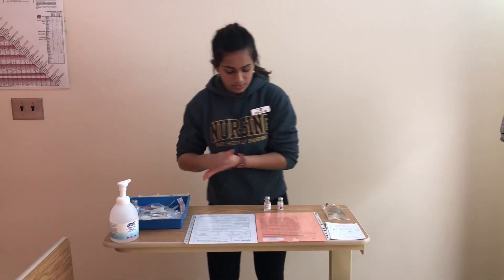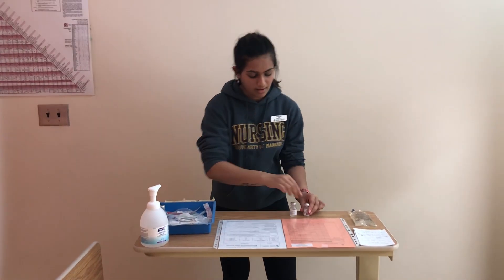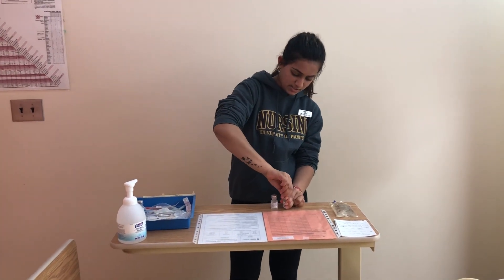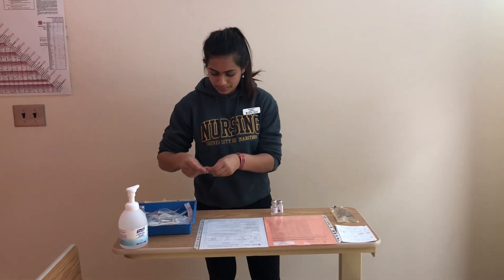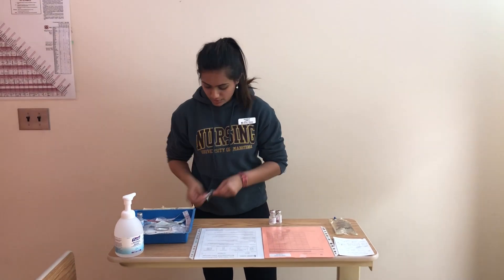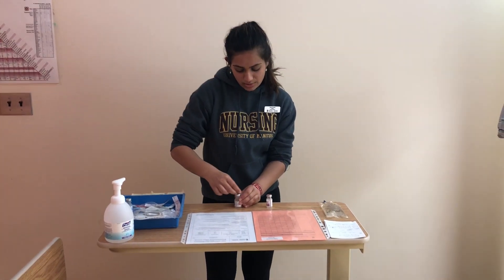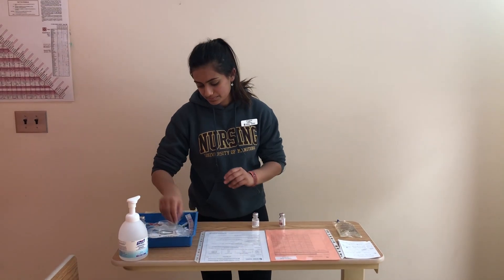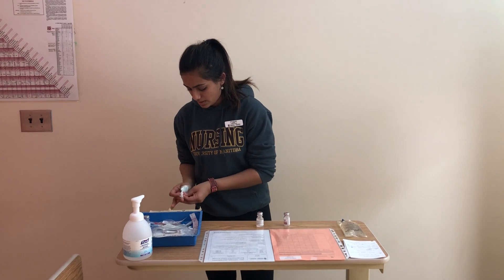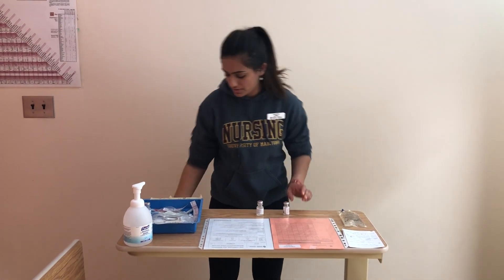I'm going to perform hand hygiene one more time and then swab my vials — both my sterile water vial and my medication vial. I would swab each for 30 seconds and let it dry for 15 seconds.